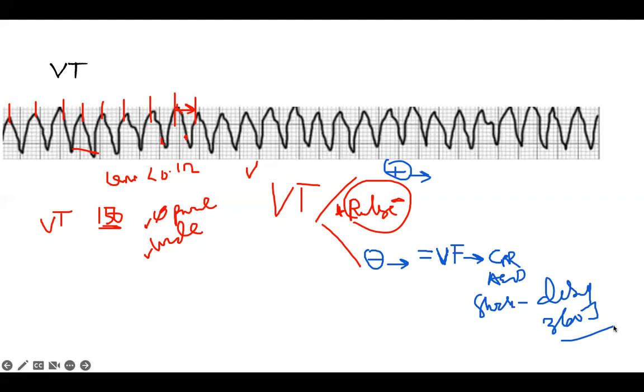I did it before this one. So it's the same thing. You defibrillate them, and the defibrillation is 360 joules. They won't go past that. If they give you this kind of question, they show you the rhythm. What do you do next? Check a pulse. And they will say, if the patient doesn't have a pulse, what do you do? CPR first before defibrillation.